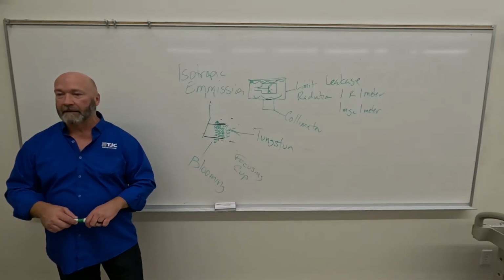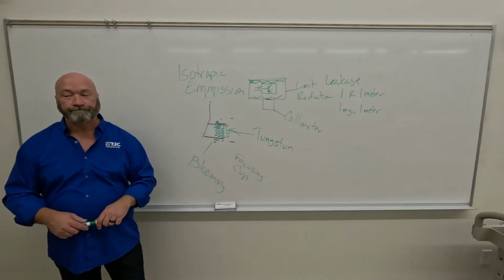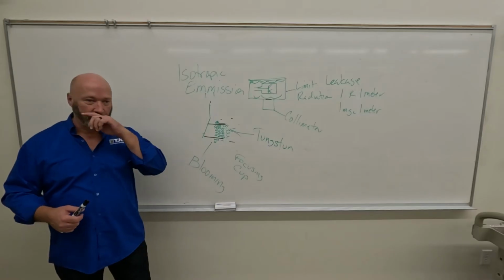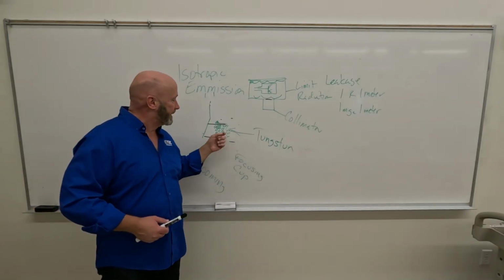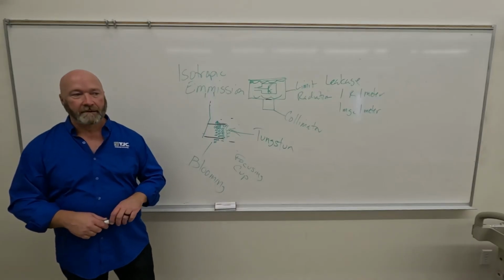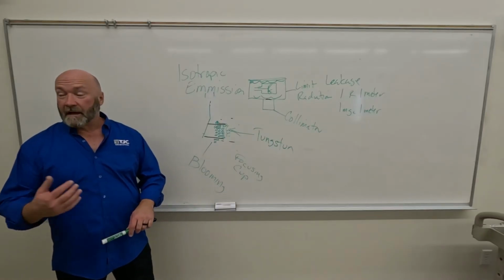Anybody got a tungsten ring? It's almost certainly not pure tungsten, because if you drop it, it's going to shatter. Okay, so again, back to the rough handling of the x-ray tube. You're dragging a tube across the room and your finger slips off the button. You got this little bitty squiggly wire inside, and your x-ray tube comes to a sudden stop. There's a very real chance you're going to dislodge that from its connector or break it somewhere. So it's not pure tungsten.